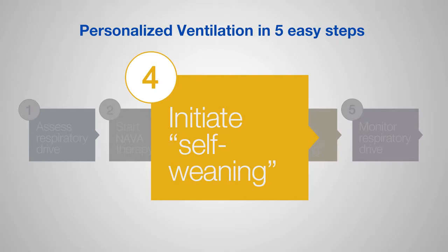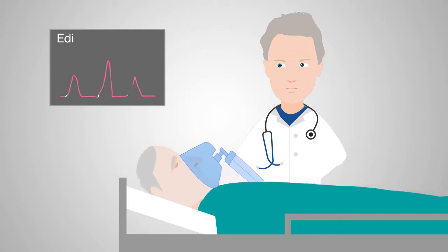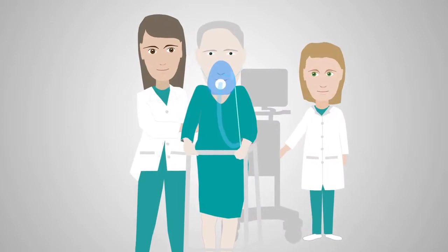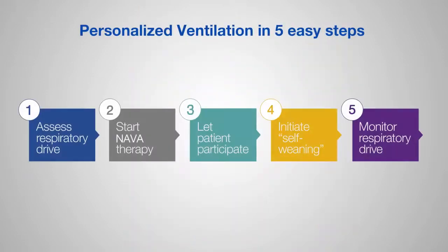Because the patient is actively participating, we can gradually reduce the level of ventilator assist. The patient literally starts weaning himself from the first minutes of NAVA ventilation. I also encourage early mobilization to enhance recovery and restore the patient's physiological strength.